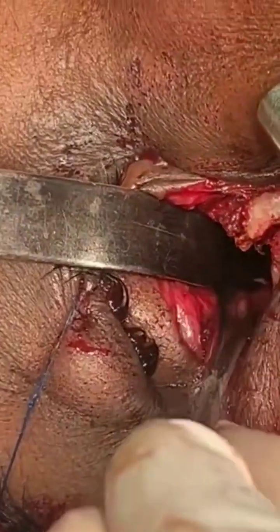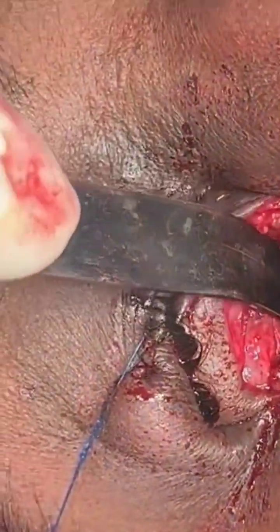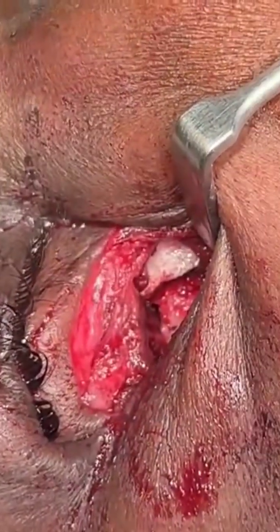So you can see how it's fractured and gone inwards. We've used a blepharoplasty incision and approach. You can see this fracture line there. I'm going to show you after we fix it.